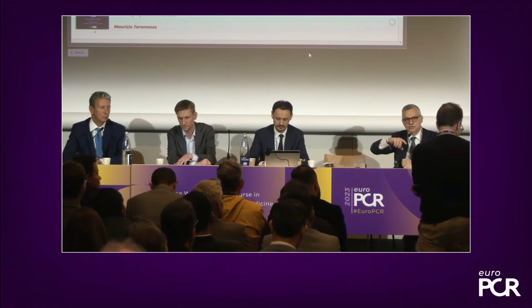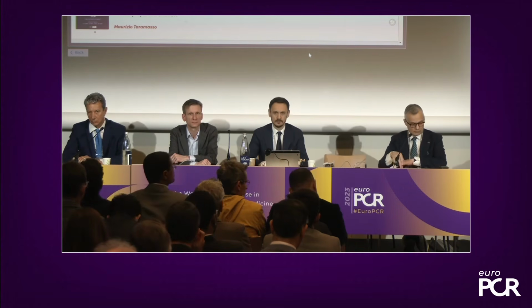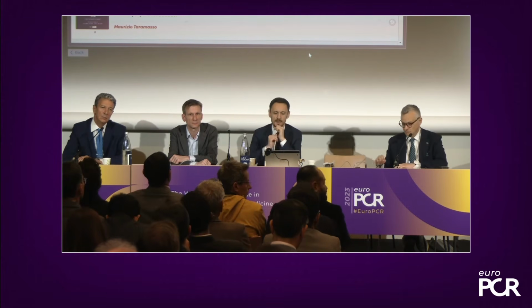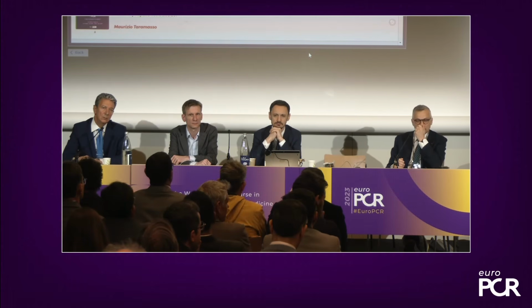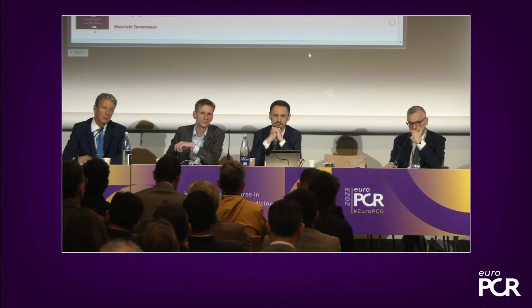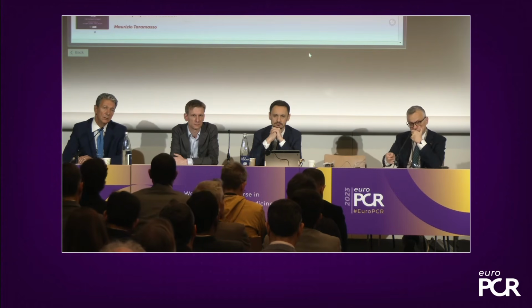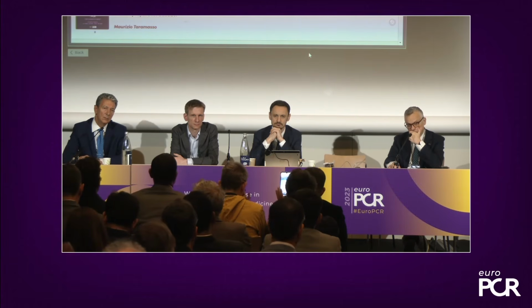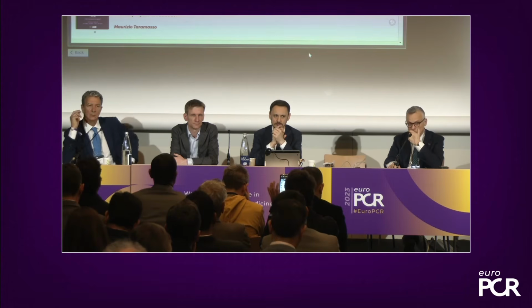Okay. There are questions from behind. Yeah, Doug Fraser in Manchester. So I think we've been doing the wrong thing. Basically, what we were doing was deploying the anchor when we saw bleed back. But then we had a few cases where there was a vascular complication, and the surgeons told us that actually we deployed it in the tract. It wasn't in the vessel. So what we started to do was to look for bleed back, but then usually advance it a bit further in until we felt there wasn't resistance pushing it in. And I think from your description, we're probably pushing it in too deep.